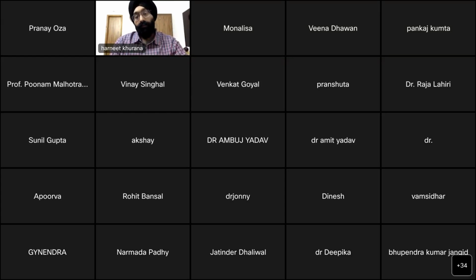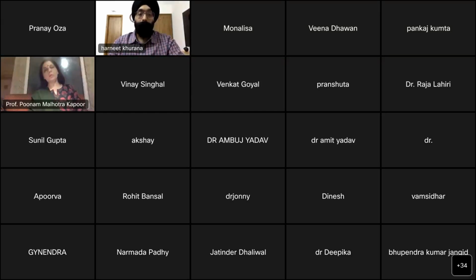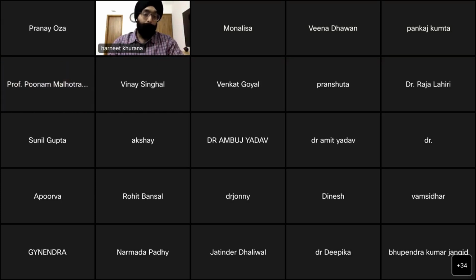See, femoral cannula is again not a contraindication. We have mobilized patients on VA ECMO with femoral artery cannula also. But it is a gradual process. What we do usually is, on day one, we try to make them move the legs with knee flexion and hip flexion. And then we see there's no hematoma or something.